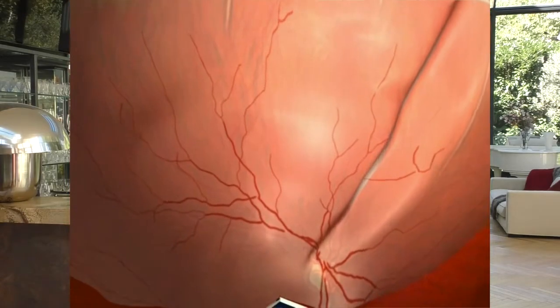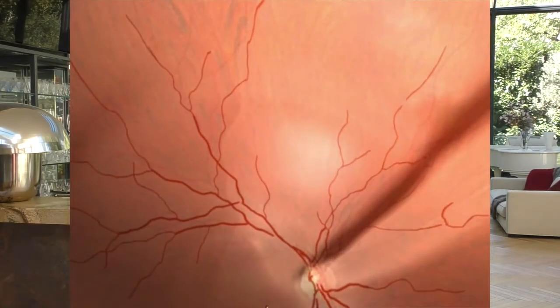We have even learned from endoscopists that any ocular perforation, even for the simple placement of a chandelier, is responsible for vitreal incarceration. When vitreous incarceration also involves the retina, it is a serious complication that must be recognized immediately in per-op in the form of a small radial retinal fold.